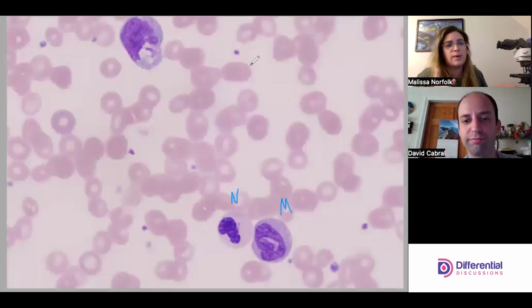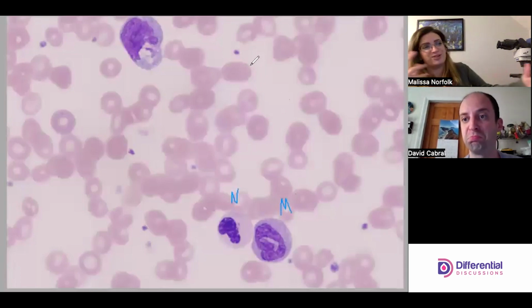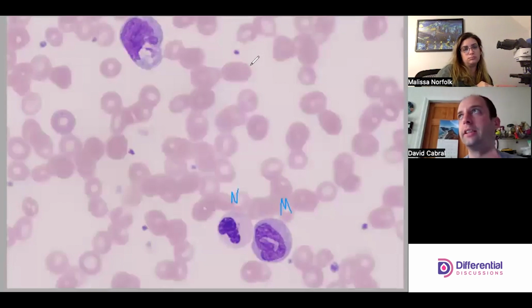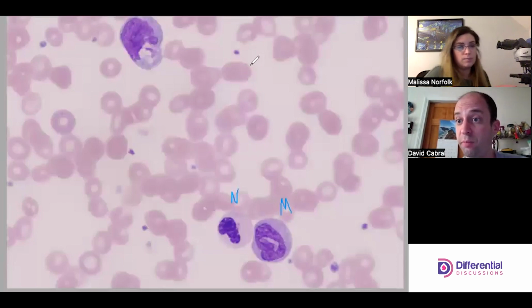It also depends on the subtype of monocytic leukemia, because some monocytic leukemias are purely monoblastic and some are monocytic, so you get the maturation sequence, and you do see the promonos. That's a good point. Things like this can encompass a lot of different mutations and combinations, right? Yeah.